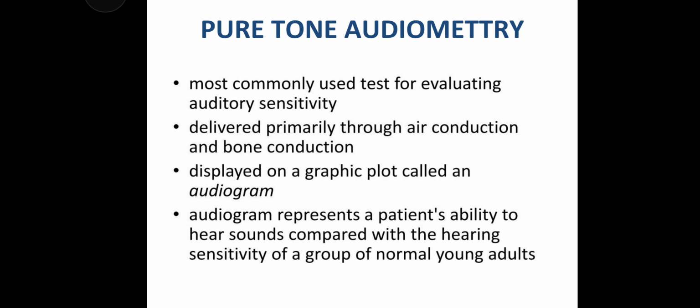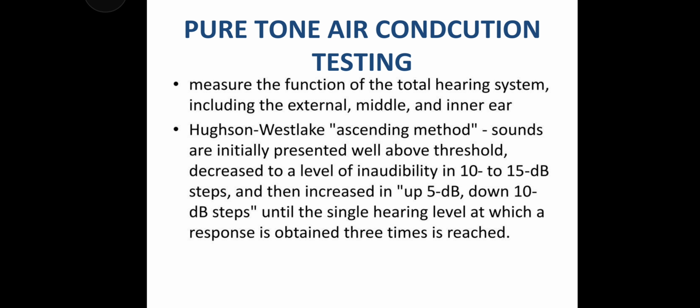An audiogram represents a patient's ability to hear sounds compared with the hearing sensitivity of a group of normal young adults. Air conduction testing measures the function of the total hearing system, including the external, middle, and inner ear.